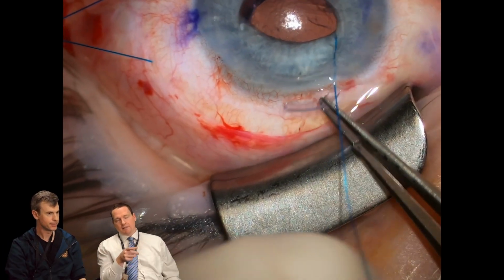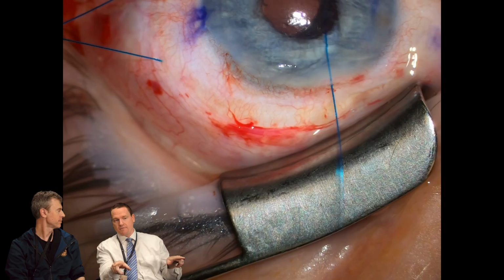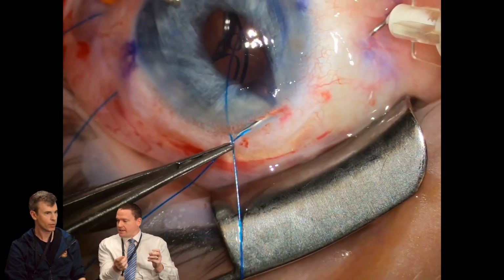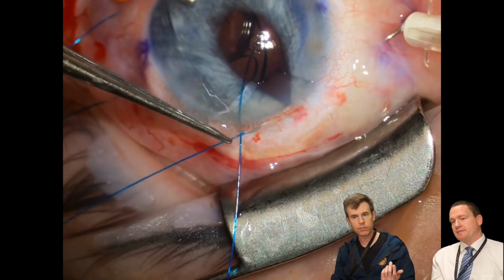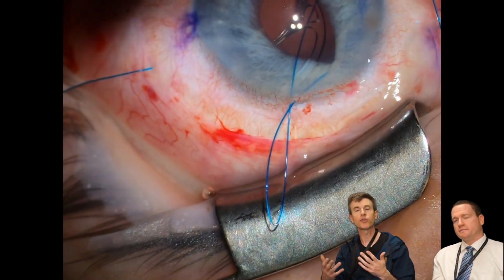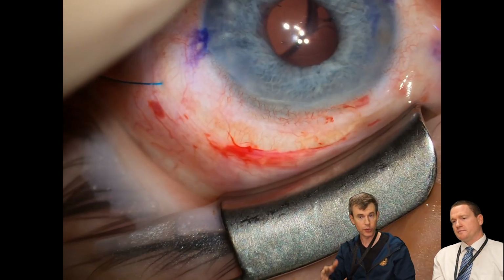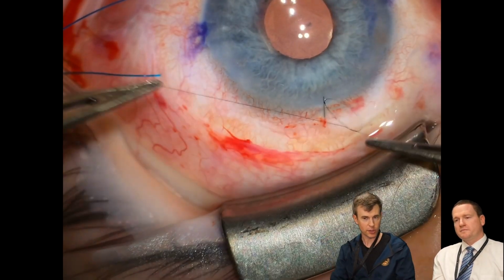Now, this type of lens implant has haptics with a hole, an opening where you can pass that through. Yep. Is that why this lens is chosen, or could you do the same technique with other lenses and create your own perforation through it, or how does that look? There are certain tools, punches, that you can place it through. What I'm concerned about is, I don't know how precise it is. This lens was not intended for the use that I'm using it for. It just happens to have that opening, and it centers, as you can see, very nice.